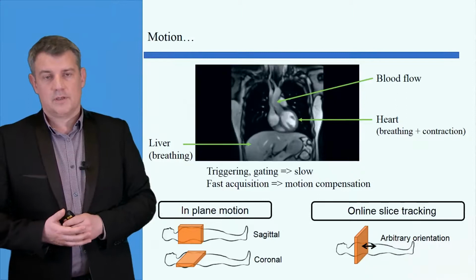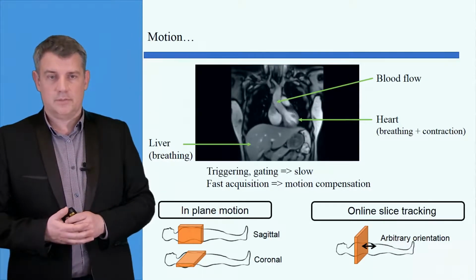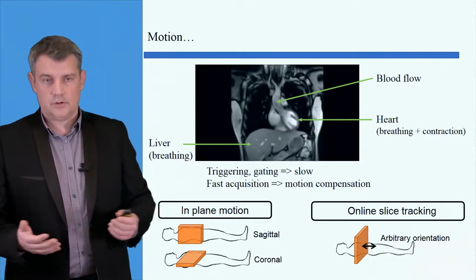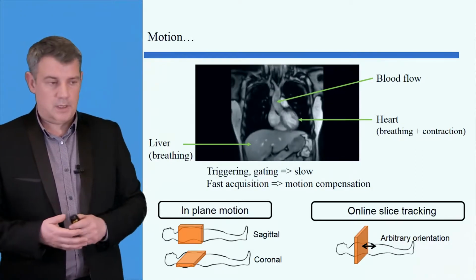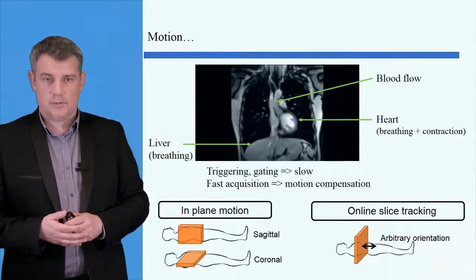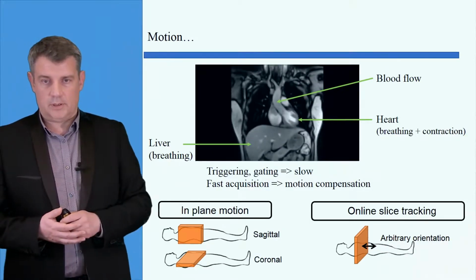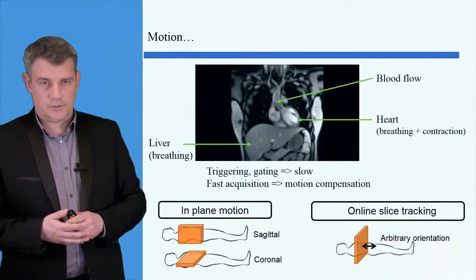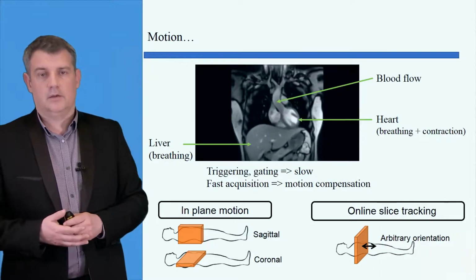Okay, from the previous slides, we have shown some more examples of the clinical treatments, and I would like to show you some potentially future directions, and for example, how to deal with motion. So these slides show, for example, the displacement of the organs in the thorax and abdomen. Let's say, for example, the liver and heart, and you have different sorts of motions. For example, the breathing, what you can see from the liver going up and down.